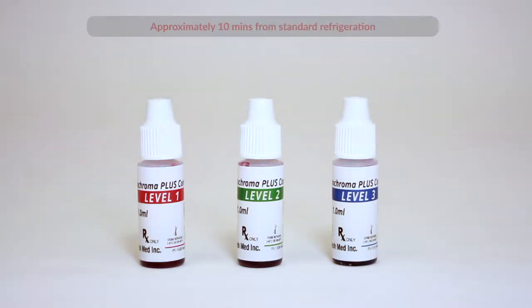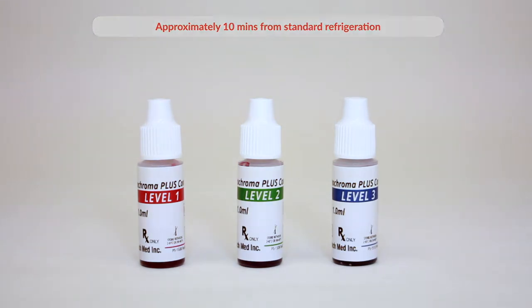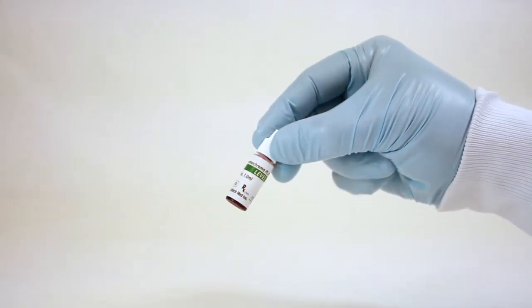Run Quality Controls. Allow the vials to come to room temperature: 15-30 degrees centigrade, 59-86 degrees Fahrenheit. Mix gently.